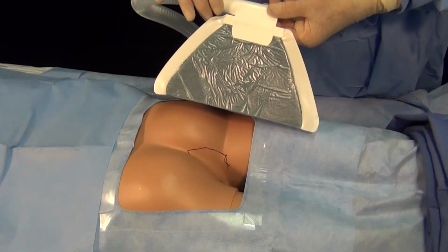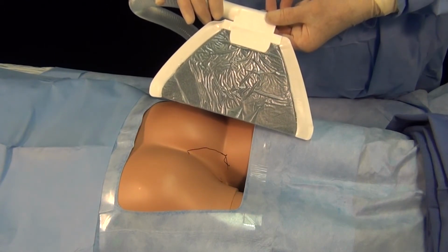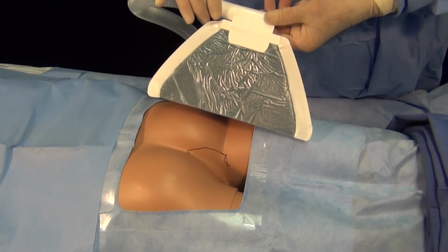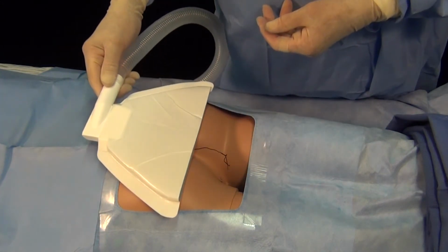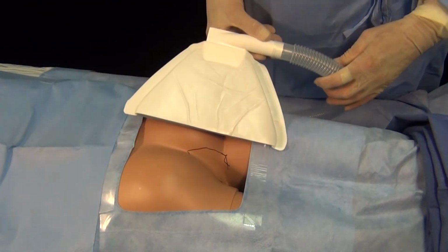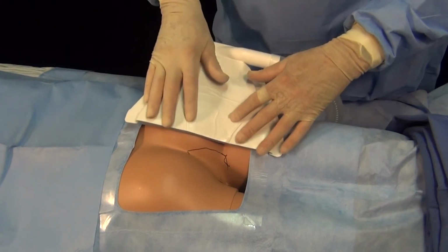Now up to the final area of concern, the perianal area, but this also holds for the anterior introital area, where you can put the miniSQUAIR as close to the line of incision as possible. In this particular case, it can be up above or to either side, and that would be just as satisfactory as a smoke capture device. For our purposes, we'll leave it right here.